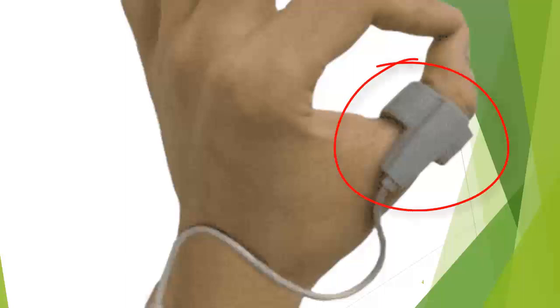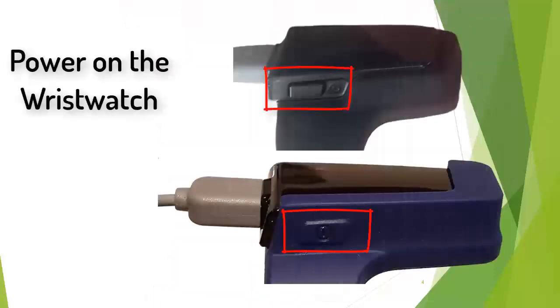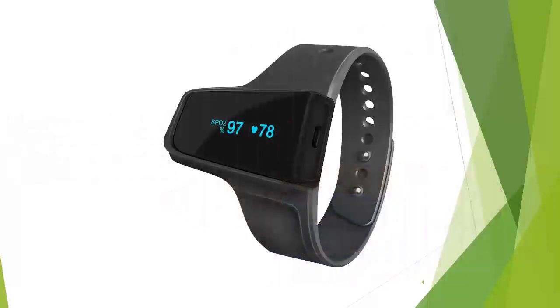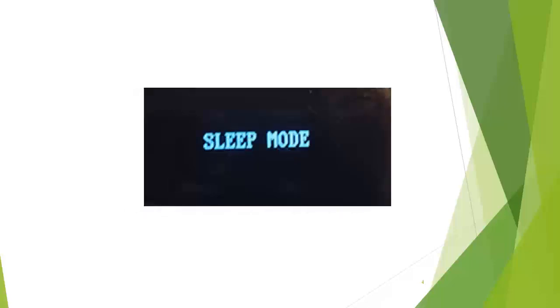Now that the wristwatch is on your wrist and the thumb sensor is on, the final step is to power on the device. Simply press and hold the button on the side of the wristwatch for 3 seconds. This will turn the wristwatch on. While the wristwatch is powering up, the screen will go through 4 phases. The first phase is mode, then it will go into sleep mode, then it will start looking for readings, and then finally it will display your reading values.